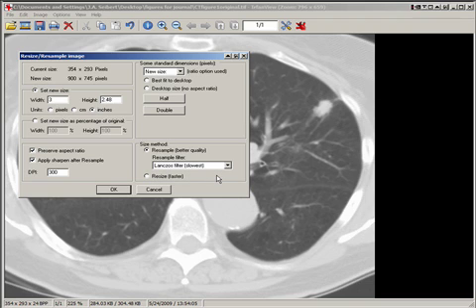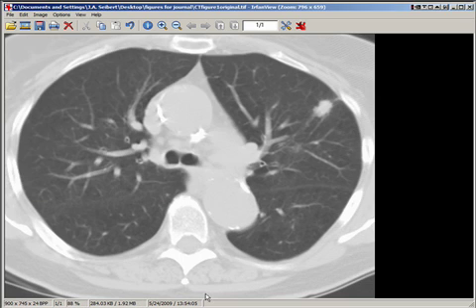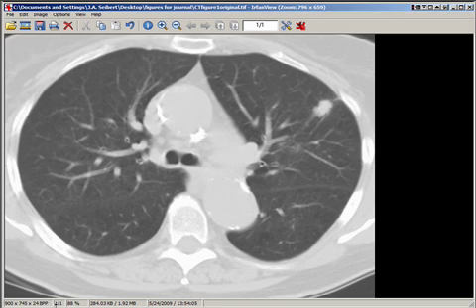The default value, using a Lanczos filter, is just one method of image interpolation that does a very nice job. If you want pixel replication, which I do not recommend, you could check the Resize box. Clicking OK will actually change the characteristics of the image, and now our image has been changed to 900 pixels by 745 pixels by 24 bits per pixel.